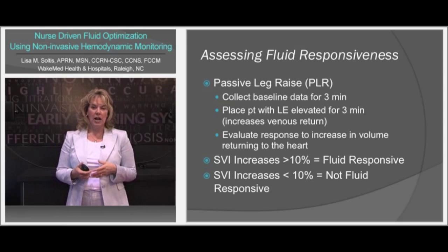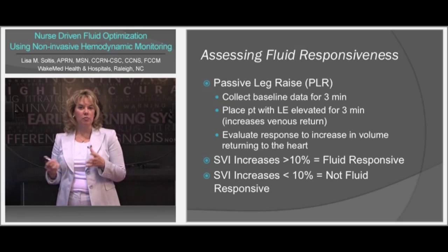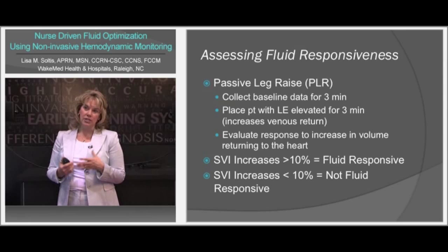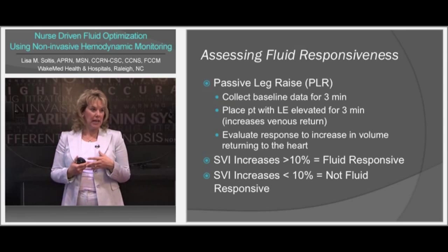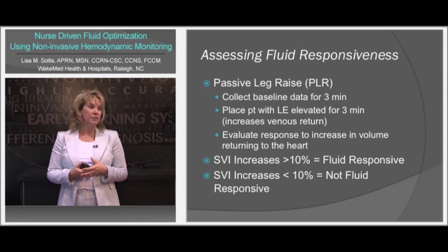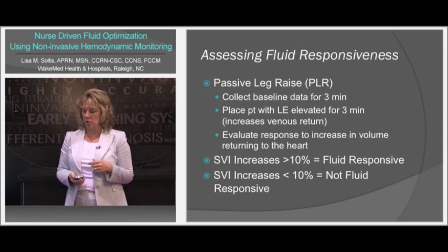The monitor itself looks at the baseline data, then it looks at what the change was when we raised their legs, and by doing that, based on the numbers that we get, we can determine whether or not they're fluid responsive. If we see those numbers go down, then we know they're not fluid responsive, and they may actually be fluid overloaded. So again, we have to look at the whole clinical picture with that.